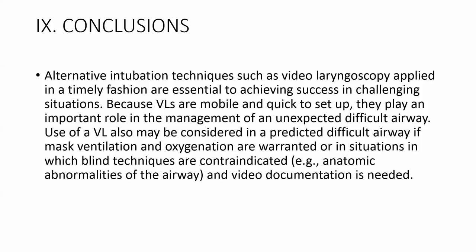The use of a video laryngoscope in a predicted difficult airway, if mask ventilation and oxygenation are warranted, or in situations where blind techniques are contraindicated, or if you want video documentation of the airway, those are situations where a video laryngoscope can be particularly useful.